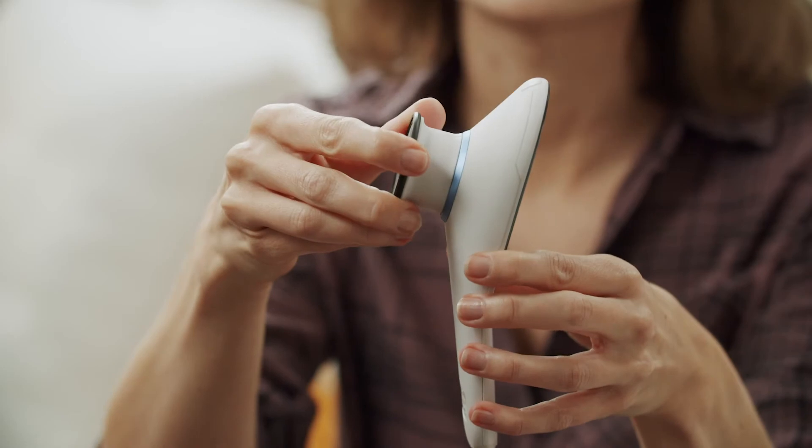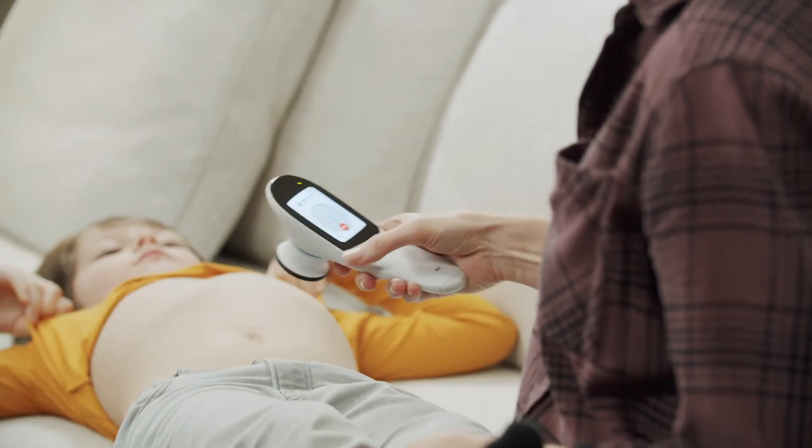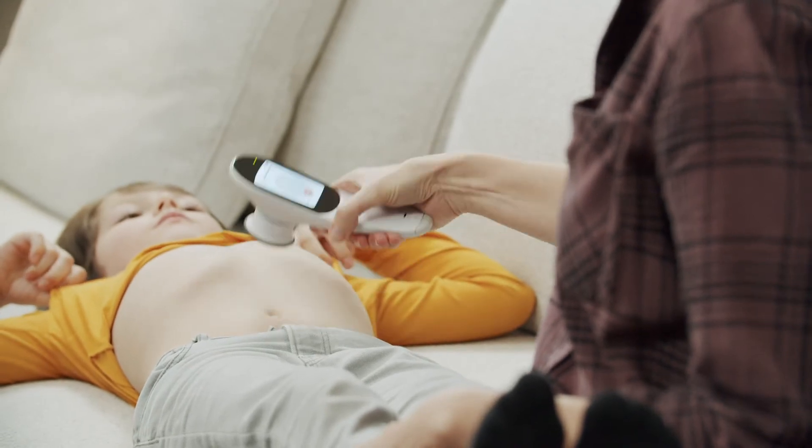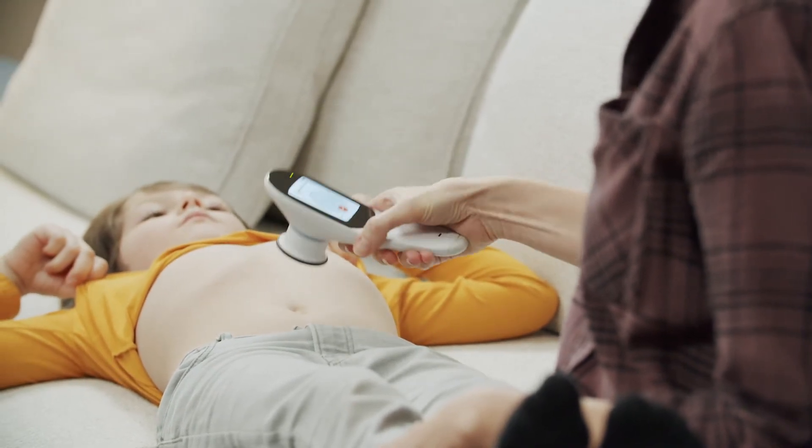Put on the stethoscope module. During the exam, follow the auscultation points presented in the manual and on the device's screen. It is important to be as precise as possible when placing the stethoscope. The exam is finished after you have recorded all auscultation points.